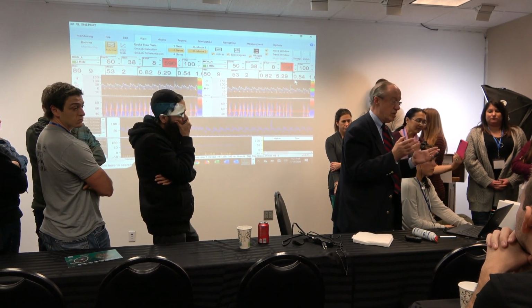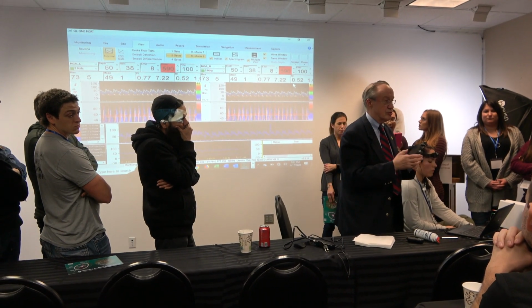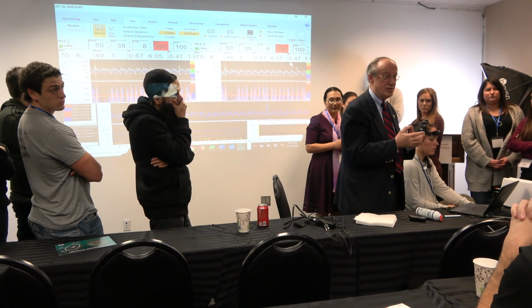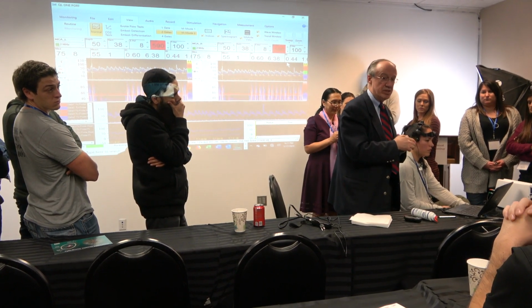We have CPT for emboli monitoring with intravenous injection of microbubbles, as I described to you for PFO determination. Right? And again, it's very easy test, but of course cardiologists would like to do TTE or TEE because $1,200, $1,500 charge versus $200. But it is more and more cardiologists using just bubble test.